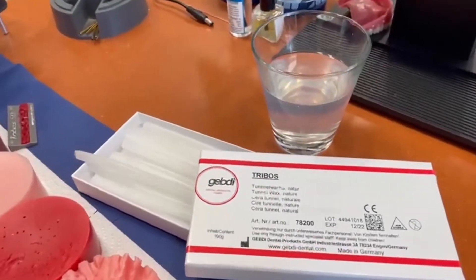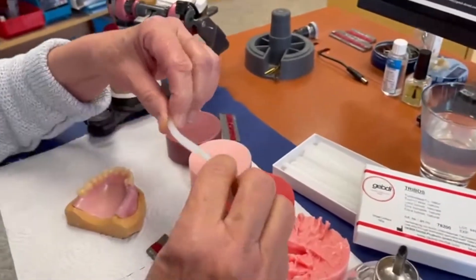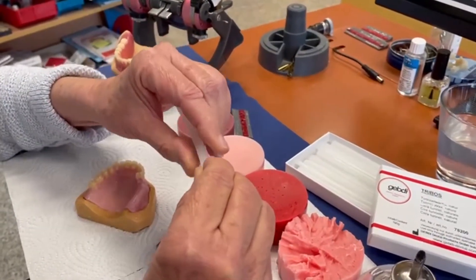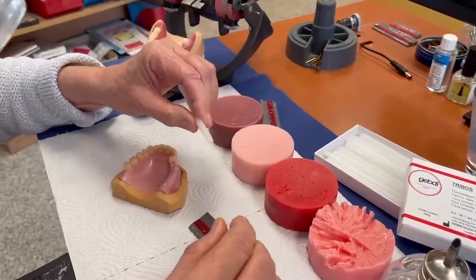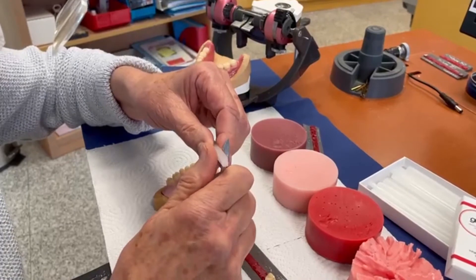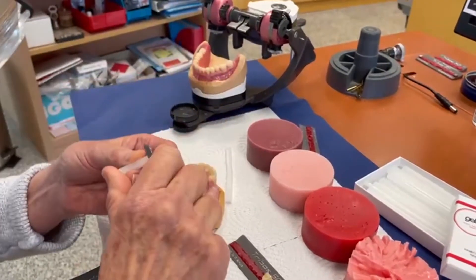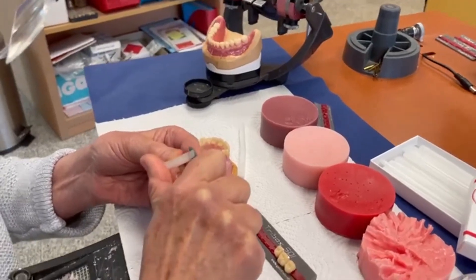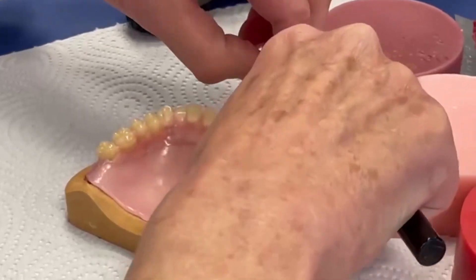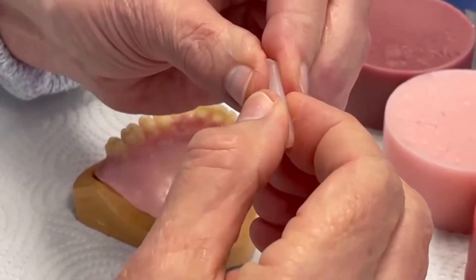It's from the triple serie and the tunnel wax has a form and it's very flexible and fixes the teeth very well. This tunnel wax will be on the base plate — you cut it firstly, bring it on the base plate, shorten it a little bit, and you can see you can form it with your fingers.